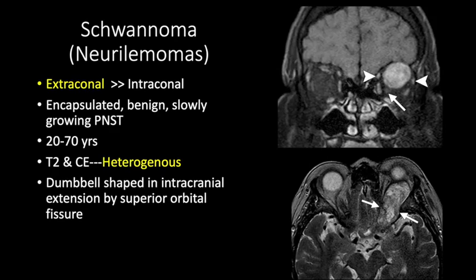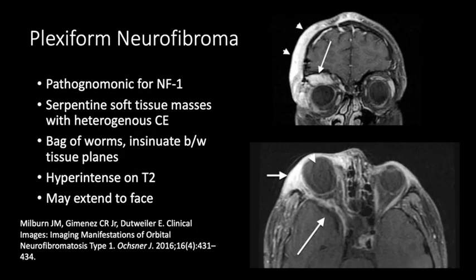Schwannomas are slowly growing mass lesions that can cause bony remodeling, expansion of the superior orbital fissure, and posterior extension into the cranial cavity. Plexiform neurofibroma is pathognomonic for NF1. It is a serpentine mass that looks like a bag of worms, extending into the face and scalp tissue, insinuating between tissue planes. It is hyperintense on T2 and shows contrast enhancement. Other findings of NF1 include sphenoid wing dysplasia, buphthalmos, optic nerve gliomas, and other NF1 features.